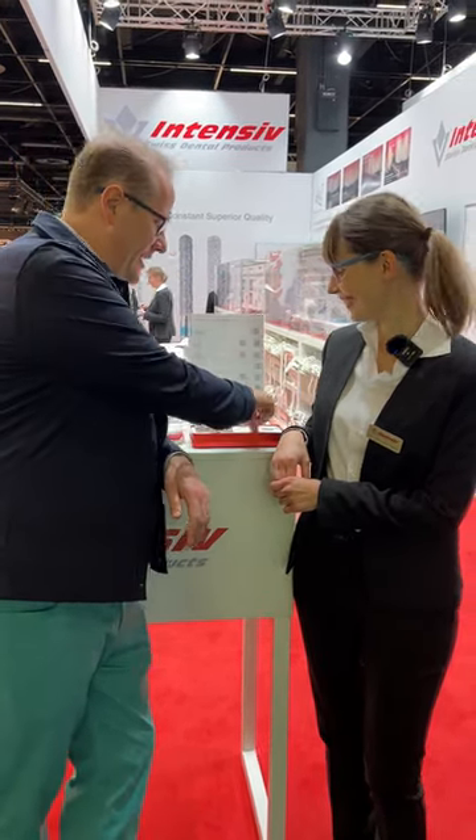Hello there, I'm Dr. Daniel. I'm here with Dr. Marcella. We are going to talk about the intensive swingle.